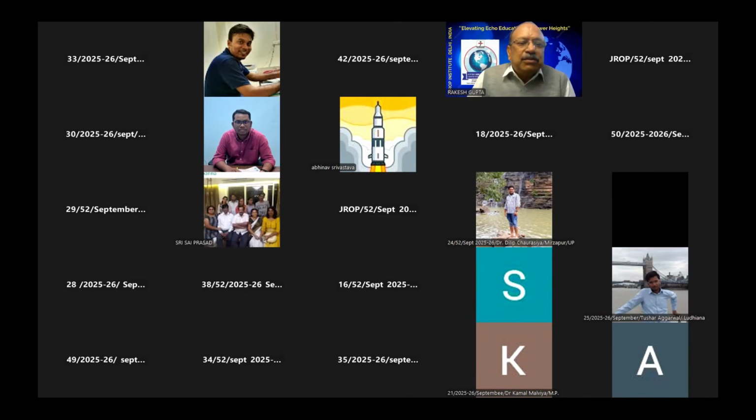The first question is from Dr. Anu, roll number 33. Yes, sir. Good evening, sir. Good evening, Anu. So, I have two questions actually. You can ask me on five. I have absolutely no restrictions for questions. I'll be happy, go ahead. From the very earlier slides of today's topic, I didn't quite get what the Nyquist limit actually is and what its role is in the color velocity.